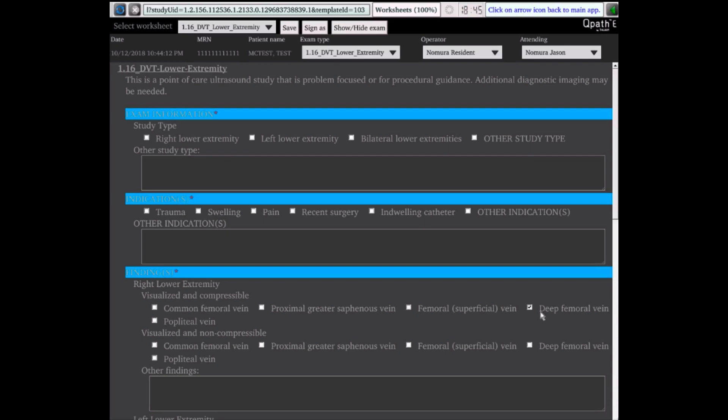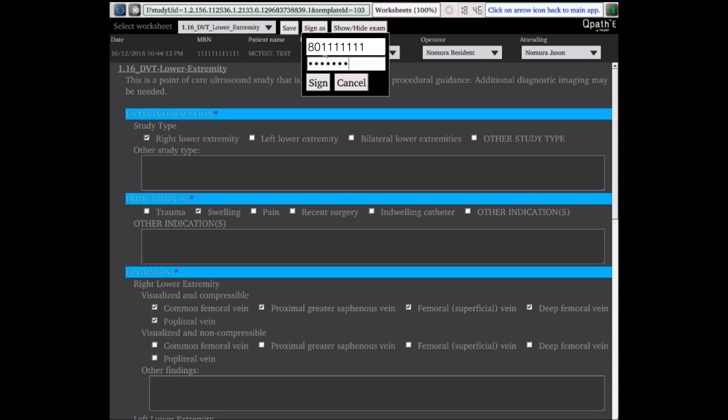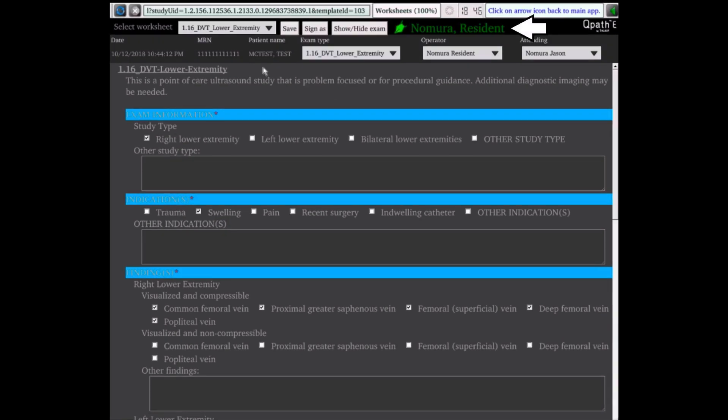Remember, QView has limited functionality to allow wireless loading to the machine. When in QView mode, the system functions like a computer — use the left set key with the trackball like a mouse click. By clicking on the drop-down menu, you can change and update the operator for the exam, the attending for the exam, and the exam worksheet displayed. Complete the worksheet as you would on a workstation computer — sections that are required have a red asterisk. To sign the worksheet, click on the Sign As button, type in your 801 number and password, then click Sign. If you have not completed the required fields, you will not be able to sign — a red banner will appear noting the worksheet is incomplete. The worksheet is now signed, displayed at the top with the pen icon and the name of who signed. The worksheet is now completed and signed in QPath-E and will be automatically submitted for review and other automated rules.